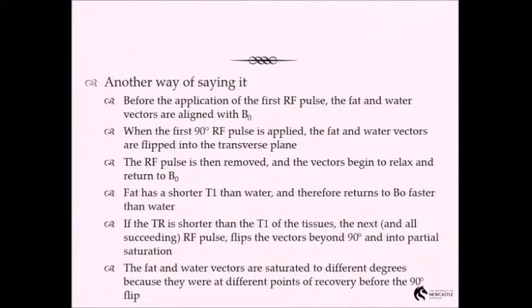MS plaques have a very characteristic distribution around the ventricles, and sometimes you can miss them through flaring of that signal. So there was a sequence that was invented that allowed you to see it. But we talk about that in third year when we talk about applications. I'm not going to go through all of this because I think I've said it all. It's just another way of saying it.